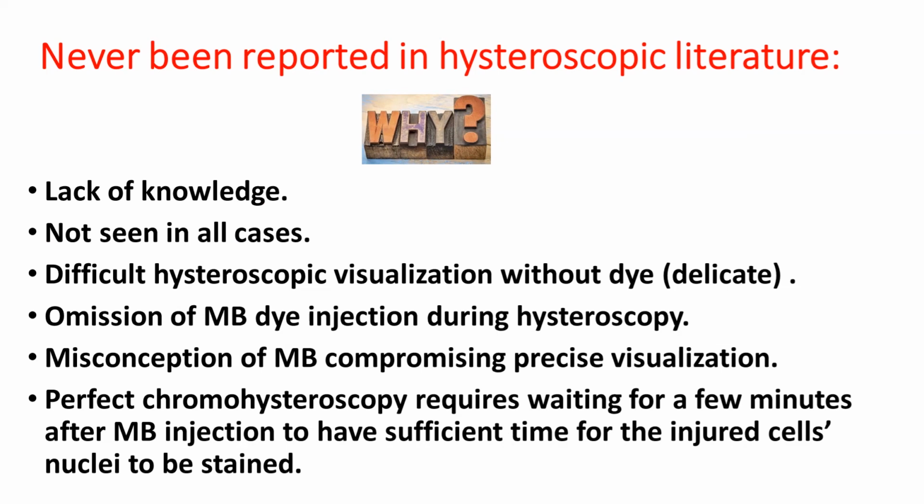Further, there is omission of methylene blue dye injection during hysteroscopy as a diagnostic tool, and a misconception that methylene blue compromises precise visualization. Perfect chromohysteroscopy actually requires waiting a few minutes after methylene blue injection to allow sufficient time for the dye to stain the nuclei of the injured cells.